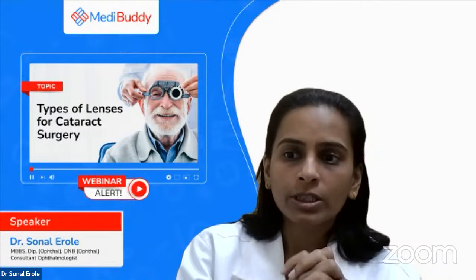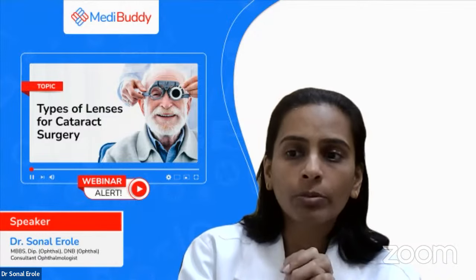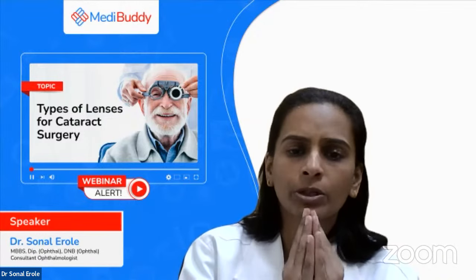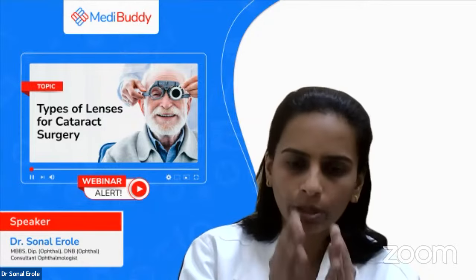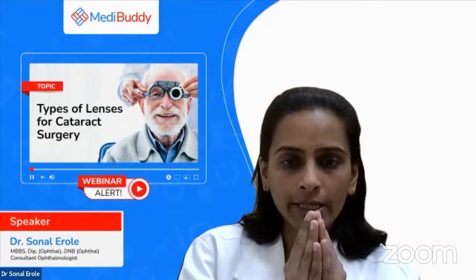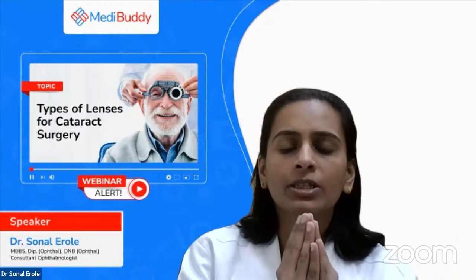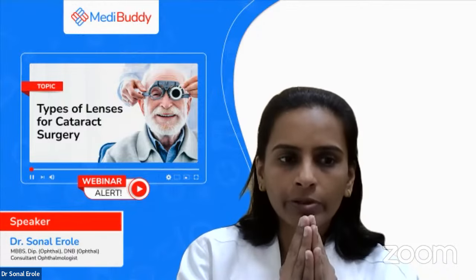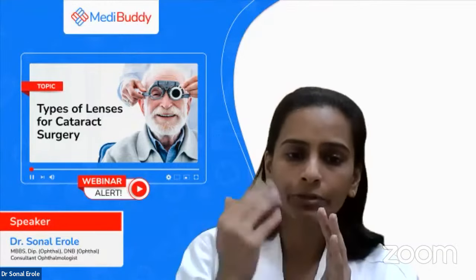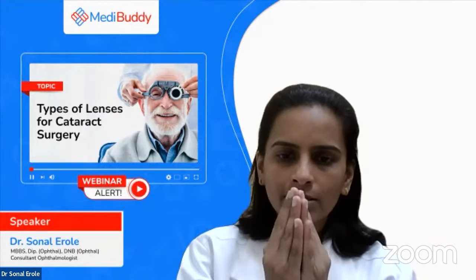Yes, it is possible to do cataract surgery on a 30-year-old also. Even newborn babies can have cataracts, maybe due to a genetic problem or birth defect, and we can go for cataract surgery even in 30-year-old patients. When a 30-year-old patient has a cataract, it is not age-related; there are different causes, but the basic pathology is that the lens is getting white.